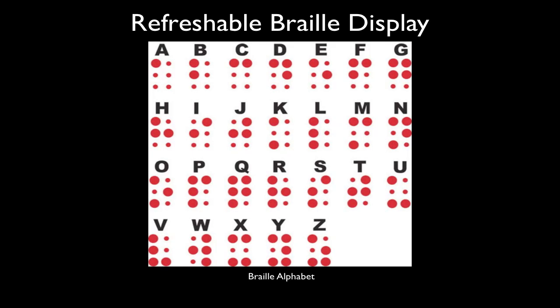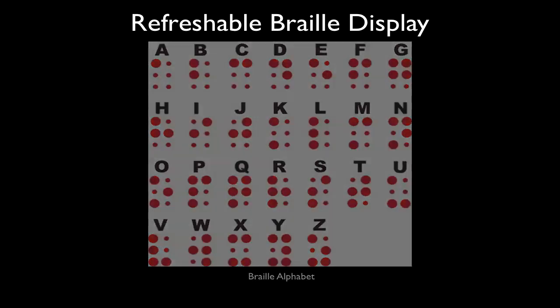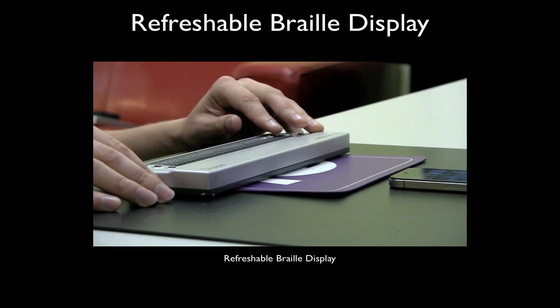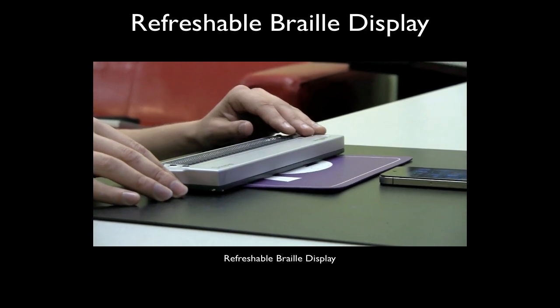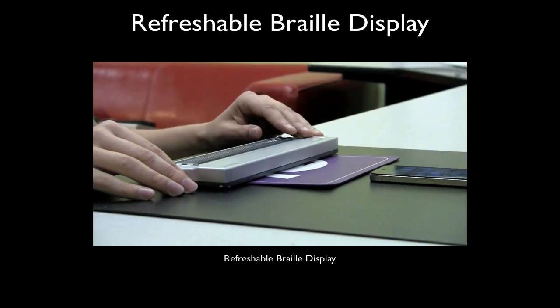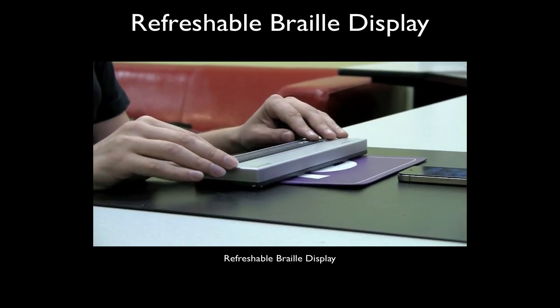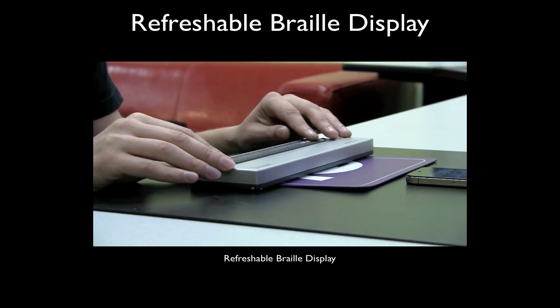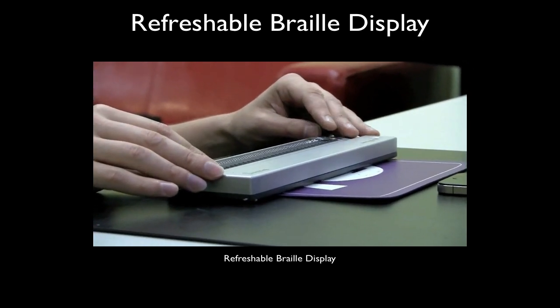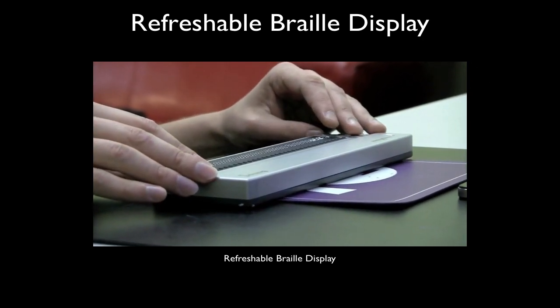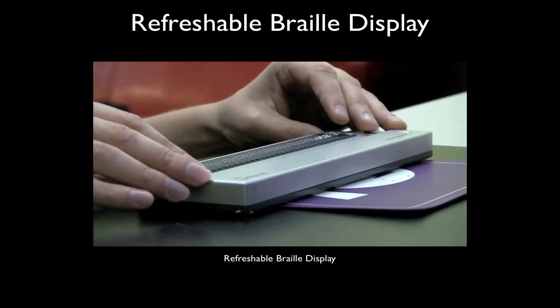Braille is the alphabet used by blind people that is composed of several dots, and these dots shape certain letters. You don't need to be concerned about the letters and the dots at this point. What you want to see is how the dots actually move on the Braille Display, because it's going to become very important.